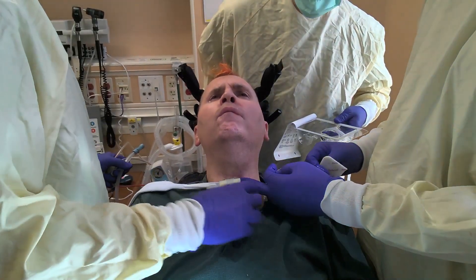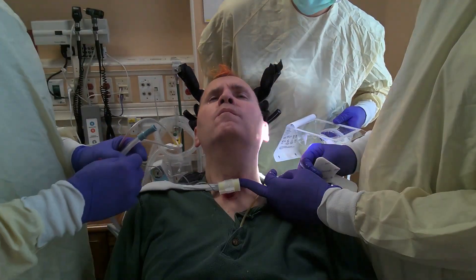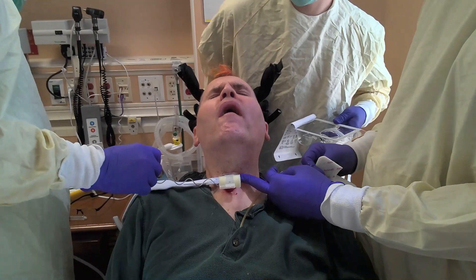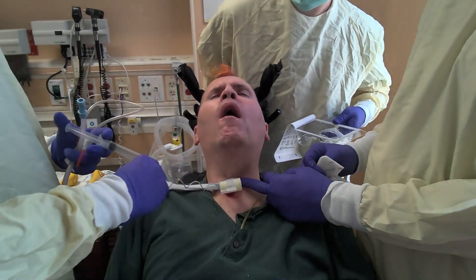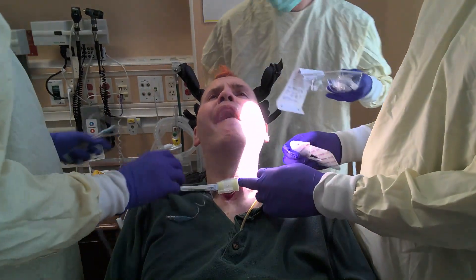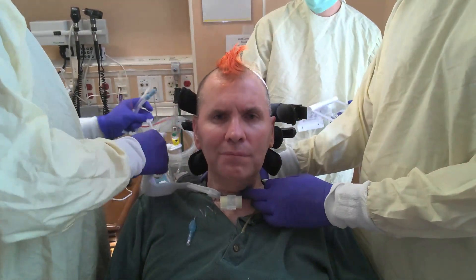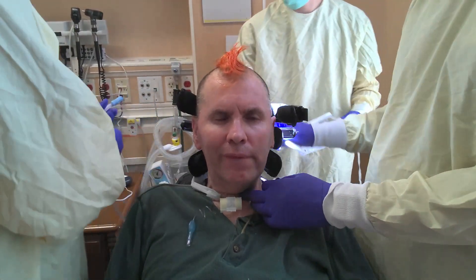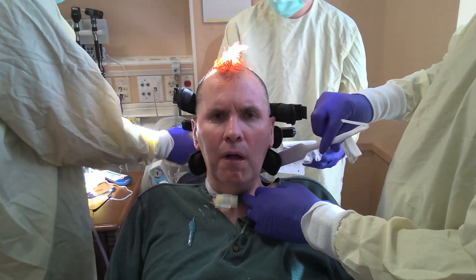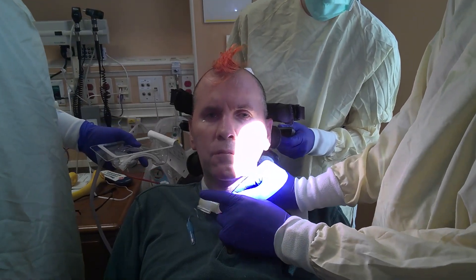I'm going to put your humidifier back on. Have you been keeping the cuff up a little bit? Let's put his head back up into a normal position.